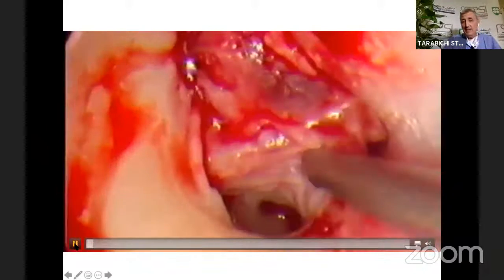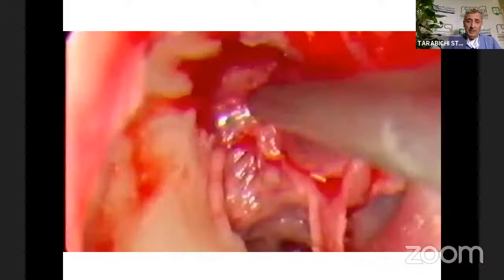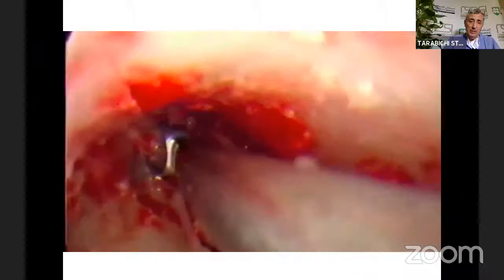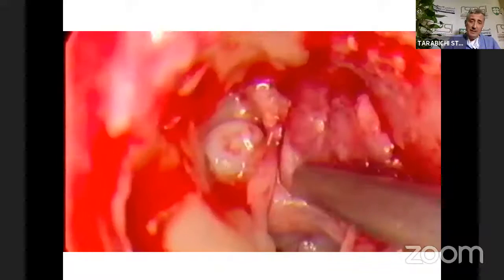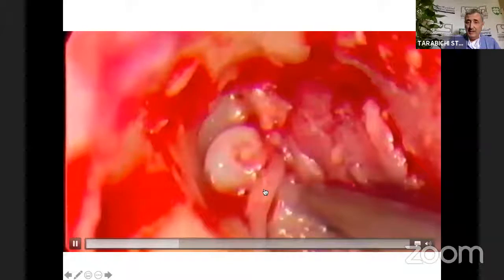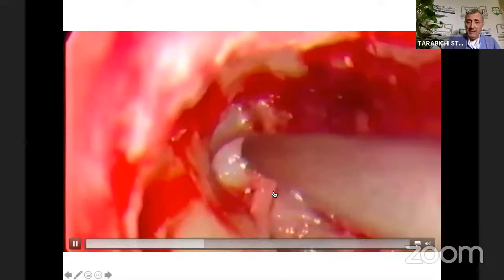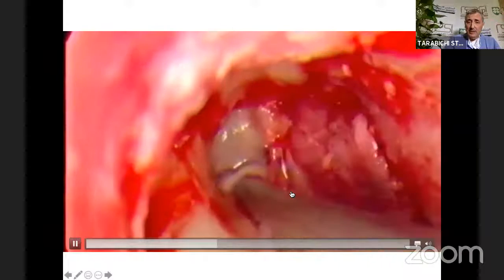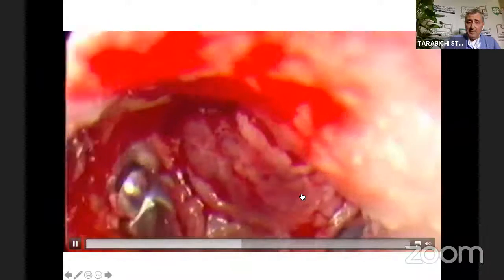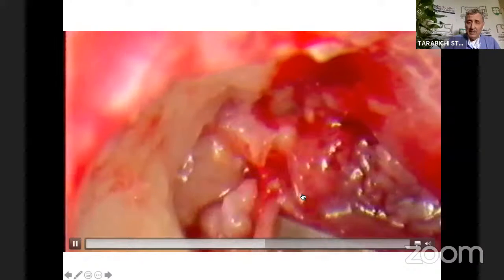So this is basically what you do in elevating the tympanomeatal flap. This is also a very, very old technique. So you take out the bone as you go, trying to expose the sac. And you can see the sac here, the chorda has formed almost like a neck around the sac, and I'm putting the sac back. And I do again a lot of this tugging and pulling, trying to preserve the sac. So I'm trying to pull the sac out.